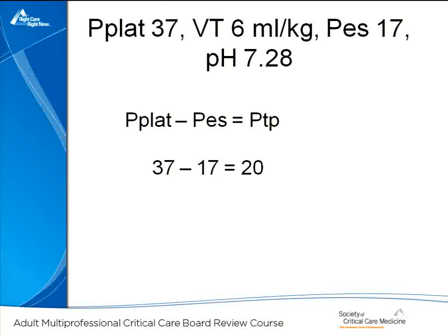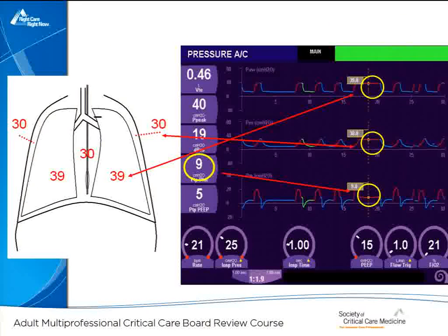But again, the take-home message I want you to remember here is that in the presence of a stiff chest wall, the plateau pressure we measure is not just driven by the lung. And we have to take into account the fact that some of this plateau may be reflecting chest wall mechanics. Again, in a patient with normal mechanics, normal chest walls, the effect is very small. But the obese, patients with ascites, et cetera, et cetera.